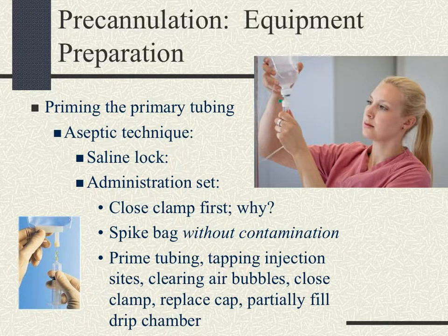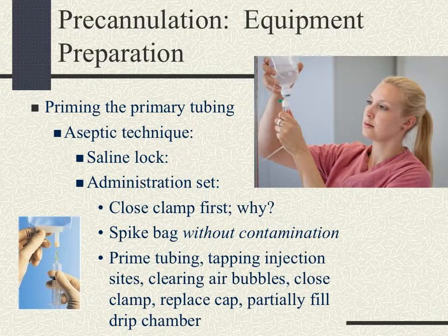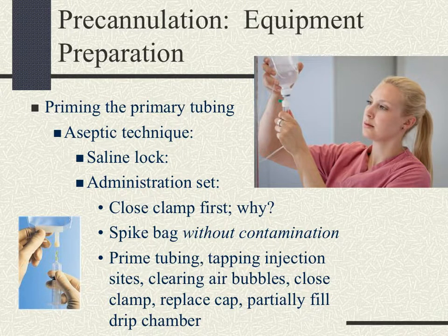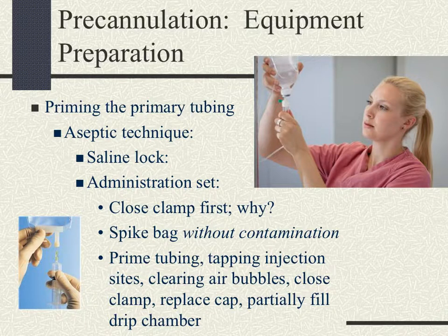Continuing to prepare the equipment, you'll need to prime the primary tubing. This is an aseptic technique, so we want to make sure we're not touching any parts of the tubing or the container where entry is at risk. For the saline lock, avoid touching the hubs to ensure no contamination. For the administration set, close your clamps first — because as you prime, that fluid will go through the tubing and you will leak fluid everywhere if your clamps are not closed.